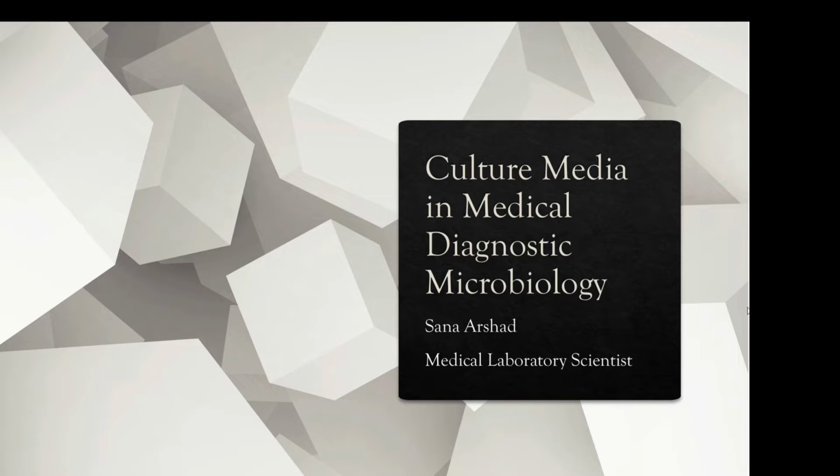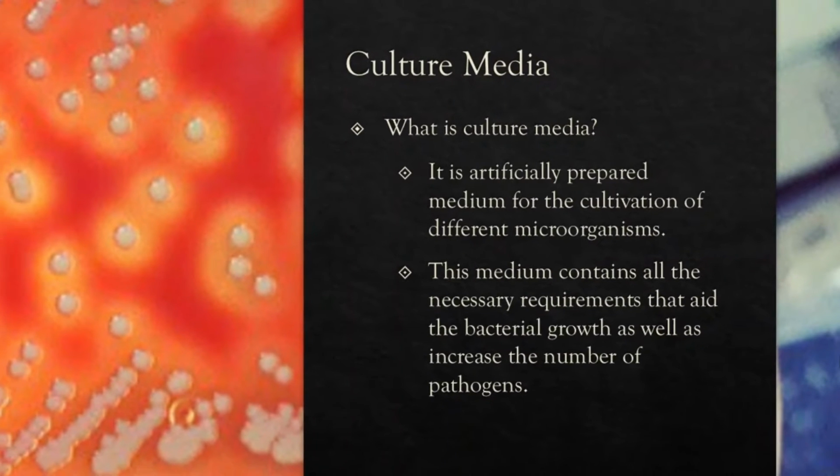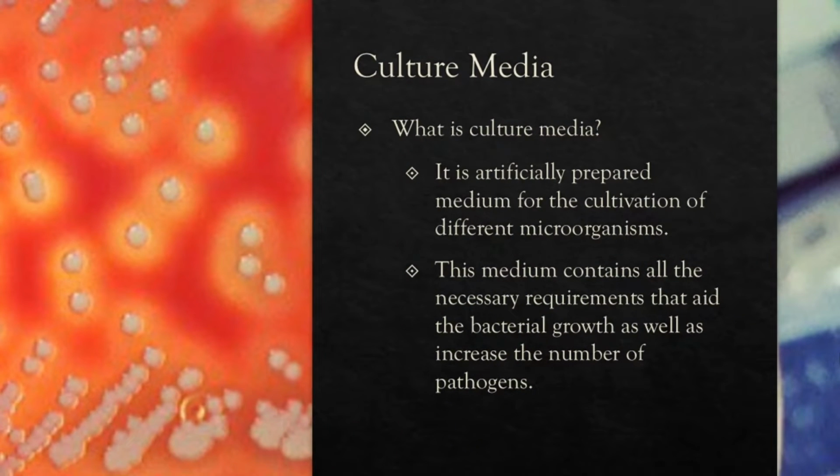So let's get started. First of all, we have to understand what culture media is. Actually, it's a special medium containing essential nutritional requirements that aid the growth of microorganisms. These microbes use these nutrients as their food for rapid growth, and their number also increases.